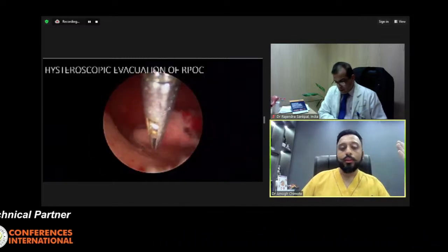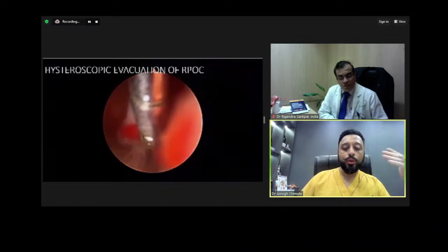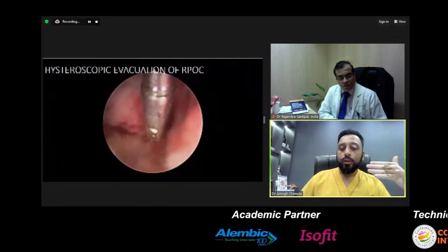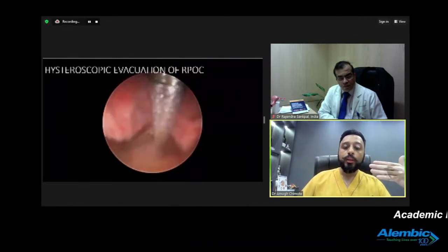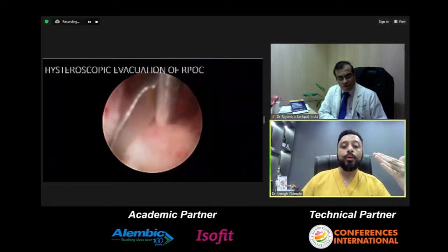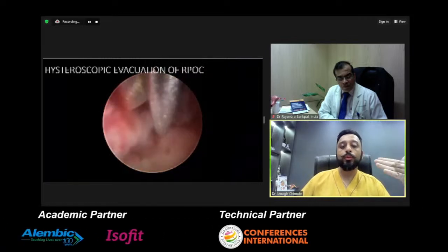Again, the trustworthy scissor. The scissor is one of the most versatile and most useful instruments in hysteroscopy. Yes, there is a place for the hysteroscopic shaver and morcellator, there is a place for the resectoscope, but in fertility sparing surgeries or fertility enhancing surgeries, the less energy you use, and the less complicated or complex the instruments you use, the better.